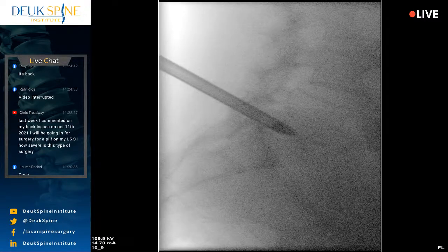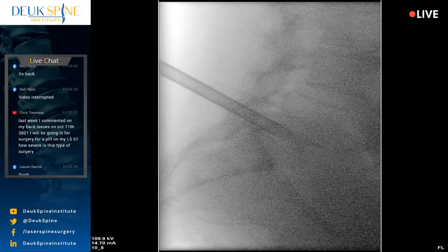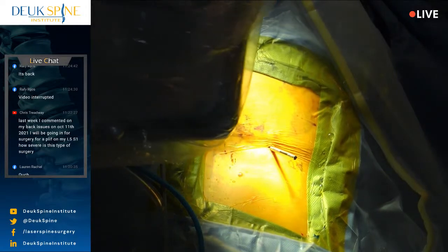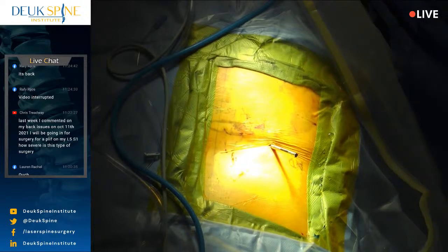All right, it's looking pretty good right there. Great job, Jordan. We're inside the disc. You can see the tube is in, and we're ready to get started. So look how much blood we've lost so far. That's literally like not even a nosebleed. If you have a nosebleed, you're losing more than that. And that's pretty much all the blood loss we're going to have for the whole surgery.